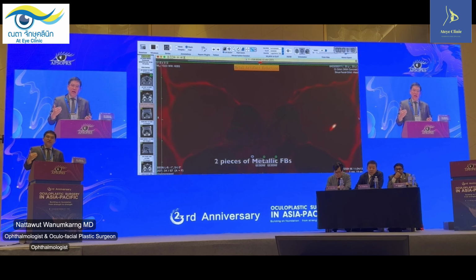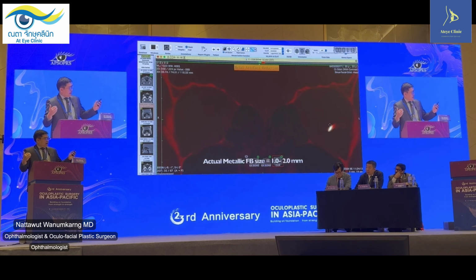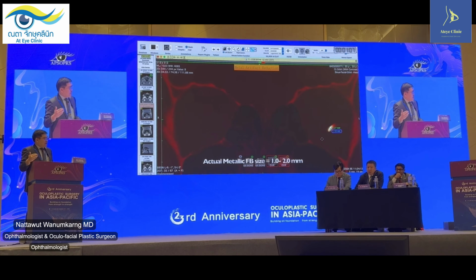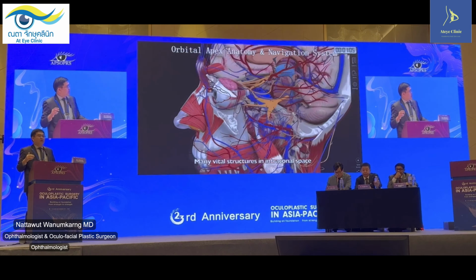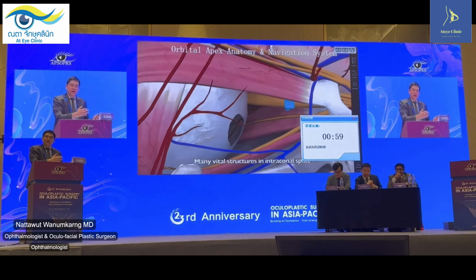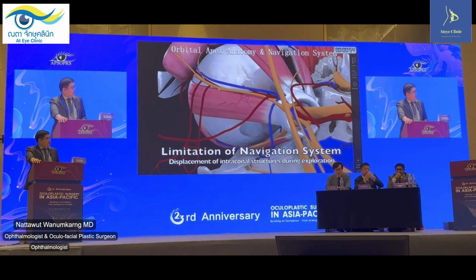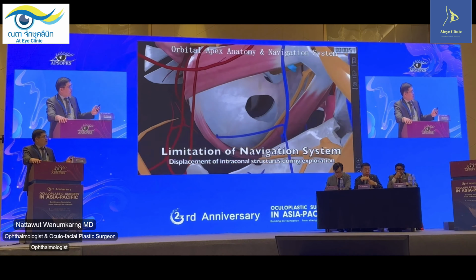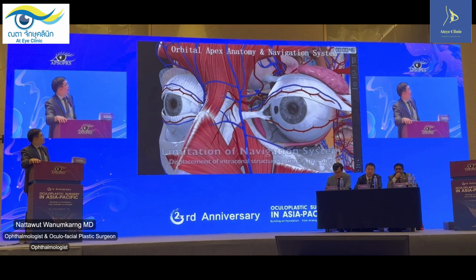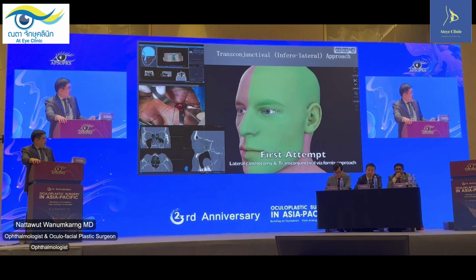So in this case, I used everything I have. I used the navigator, but when we went into the operation, it was not that easy, because every time you put pressure on the globe, it pushes the foreign body away, and at this point the navigator does not help. And this application you can use for teaching and learning, and for your presentation also. This is the operating room, and this is the first attempt.